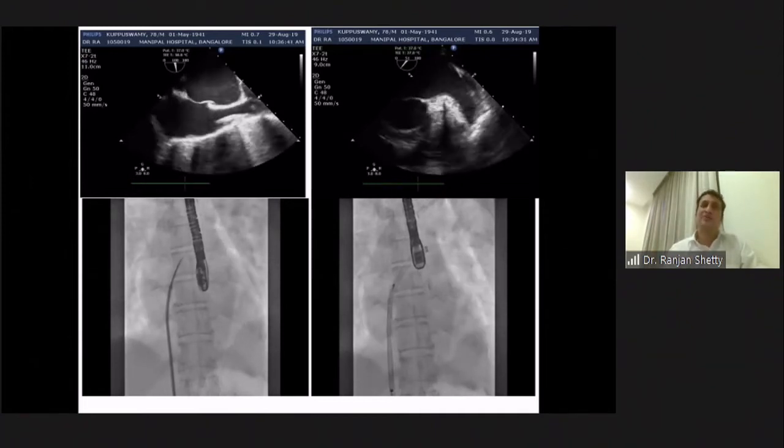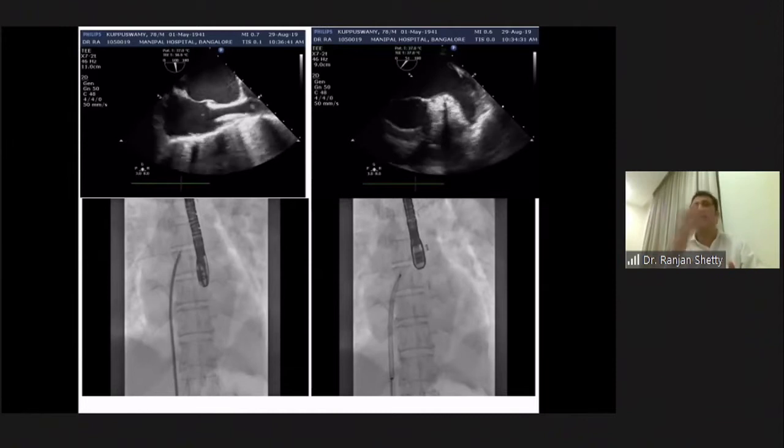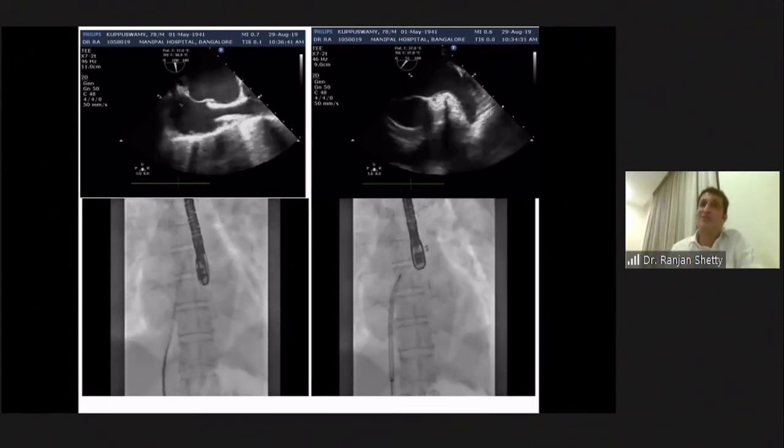There are MitraClip, the valves, and so many procedures, so we need to learn this. The septal puncture position varies in all these procedures, but what doesn't vary is the technique. In the sense, once you understand where to puncture, it works.